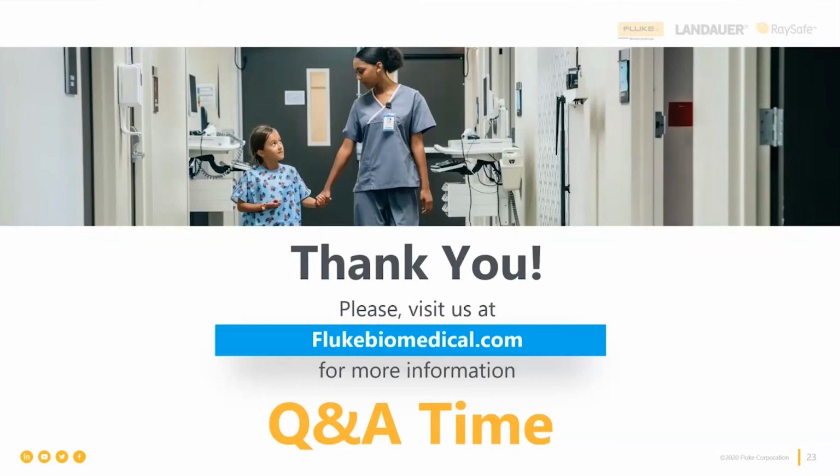In the other full ACLS type defibrillators, the energy setting is dialed in by the doctor. The doctor is prescribing a therapy, and so it's not just any old setting. It's set values that are designed into the particular brand and model of defibrillator, that the doctor dials or causes a nurse to dial in, and then delivers the energy. So no, there's no prescriptive energy level.